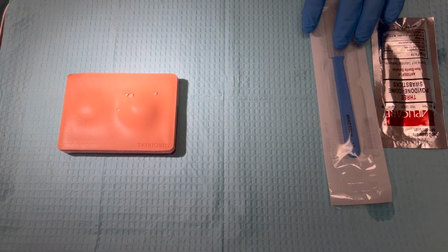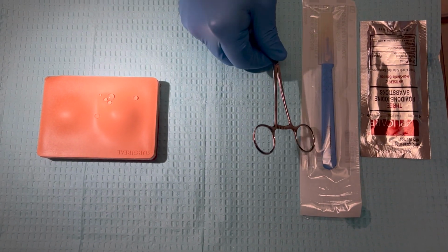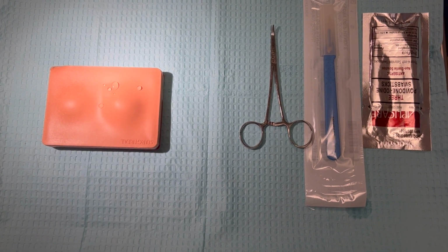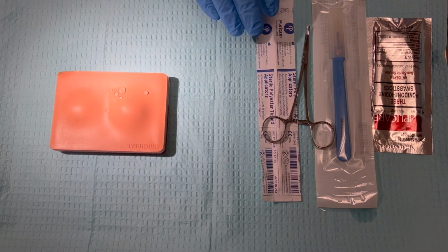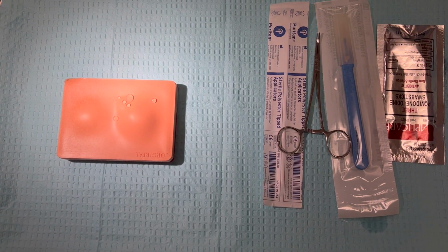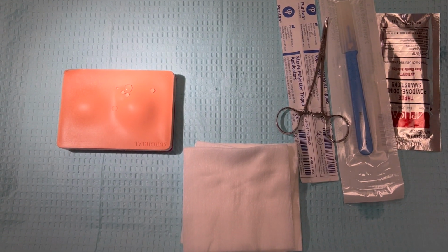I'll start with my betadine solution that I'll clean the area with, my scalpel to make the incision. I'll put out curved hemostats that I'm going to utilize in order to help break up loculations. In this setting, we're going to use this as our culture swab in order to get a culture, if that's indicated. We'll go over those indications in a bit. And then ultimately, of course, we want to have ample gauze available as well, anticipating potential release of purulent tissue.